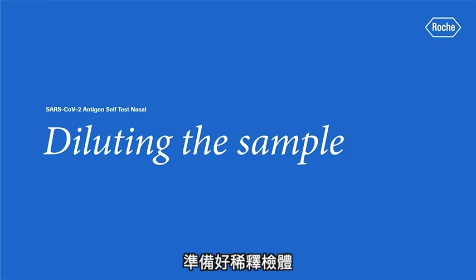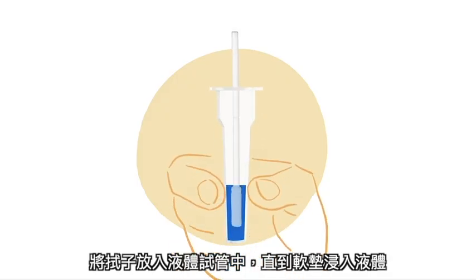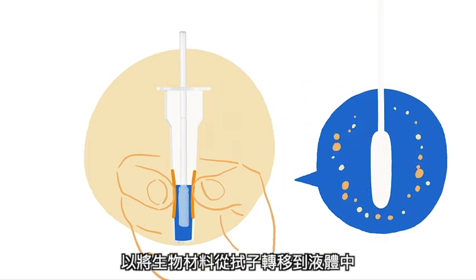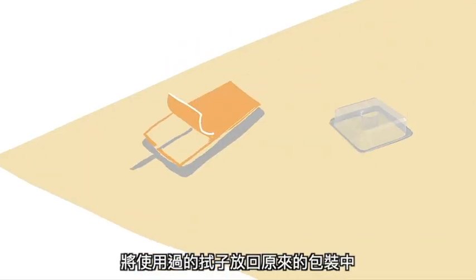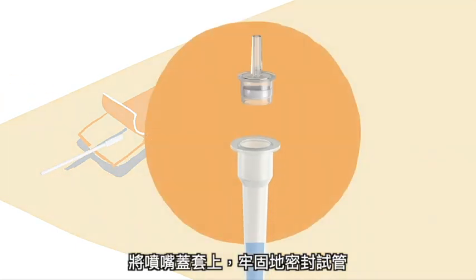Get ready to perform the test. Insert the swab into the tube until the soft pad is submerged in the liquid. Squeeze the tube at the bottom where the tip of the swab is located and hold it tight. Stir the swab more than 10 times to transfer the biological material from the swab to the liquid. Keep squeezing the sides of the tube while removing the swab to properly extract the liquid from it. Dispose of the swab — you can put it back into its packaging for now — and seal the tube securely with a nozzle cap.